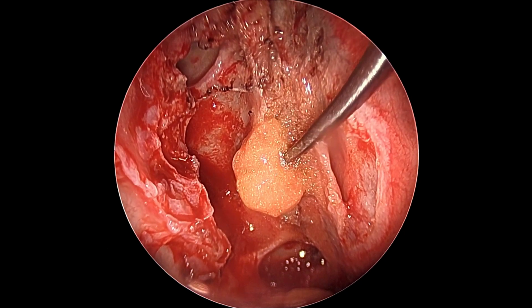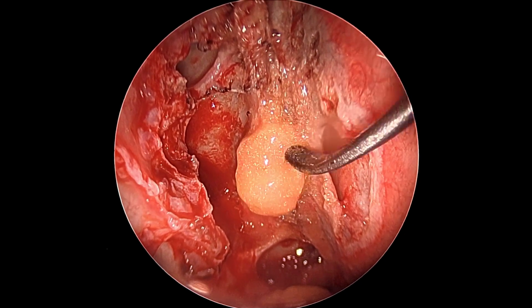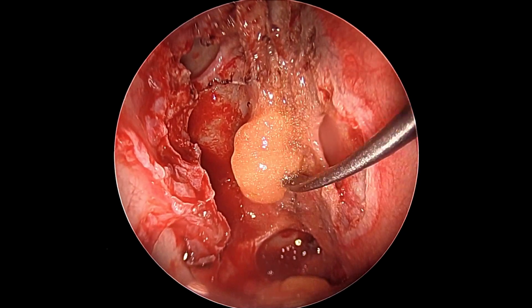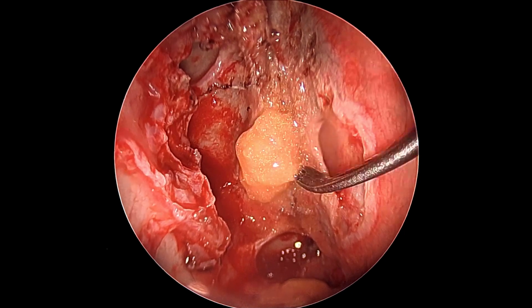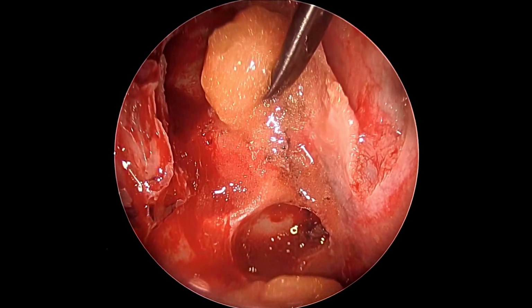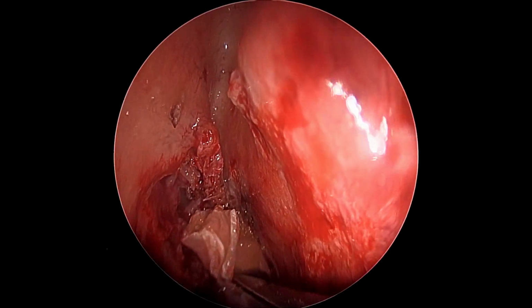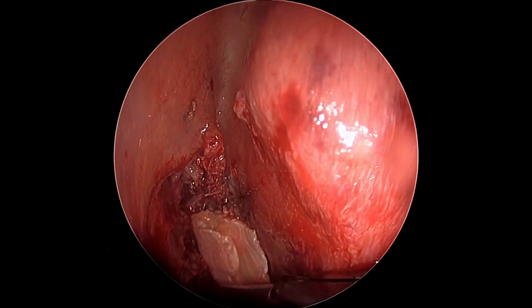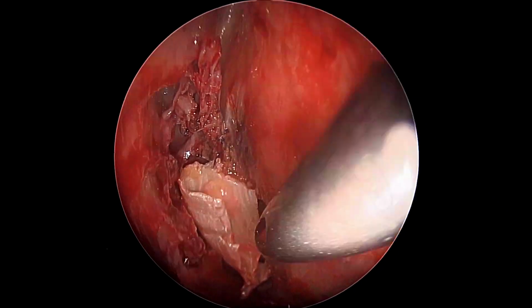So slowly and slowly, as we keep doing it, you see that the fat very nicely gets tucked in and seems to be creating a good seal. We do not want to push all of it inside. That's not the point. This fat, of course, would need something on top of it. In this case, we are using a fascia lata from the thigh wound.